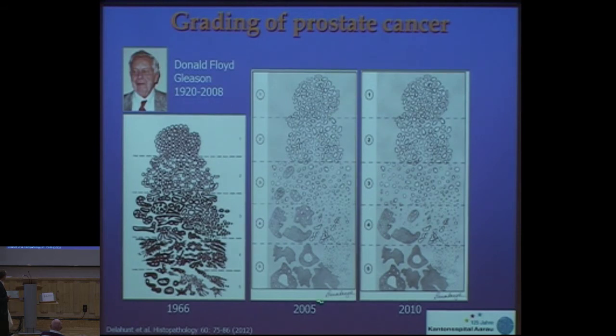And if you look here, after like 40 years, nothing happened. Then within 5 years, another thing happened. You know, as you see, this is the original publication from Epstein and colleagues for the Consensus Conference in 2005, and now the new Bible of the pathologists, the Atlas of Tumor Pathology from the Armed Forces Institute of Pathology came out, and as you see, somebody photoshopped this.